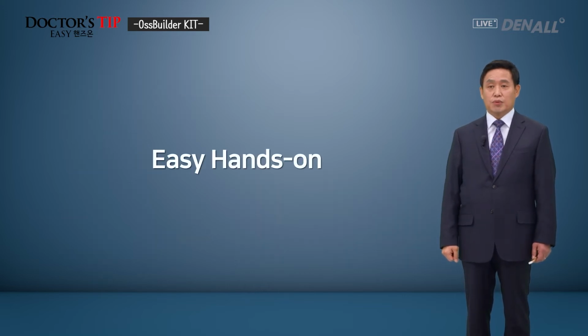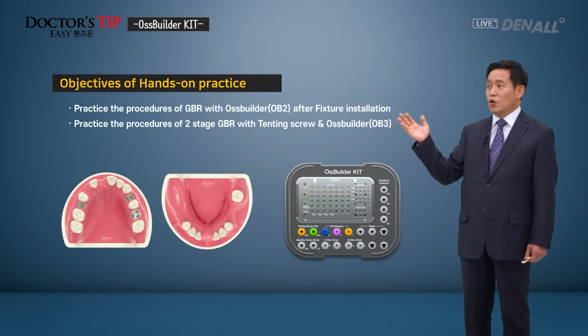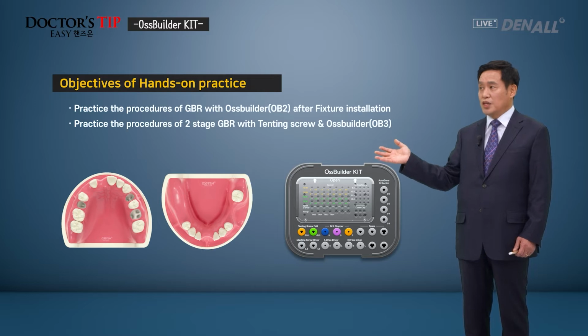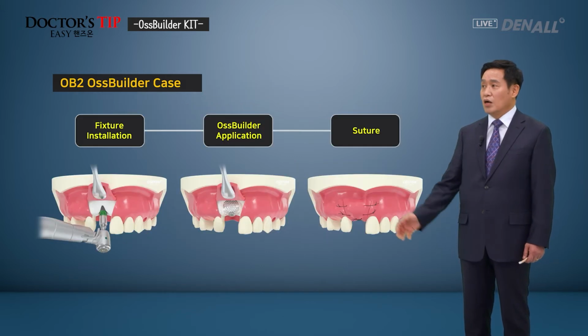Let's look at the easy hands-on. Today at Easy Hands-On, OssBuilder 2 will be used to place an implant and GBR will be performed. After that, the tenting screw will be used. OssBuilder 3 is going to be used for two-stage GBR. The tenting screw will be connected and OssBuilder 3 will be used for GBR.